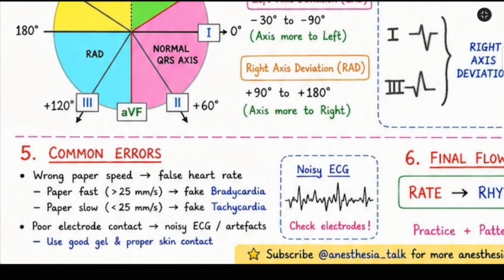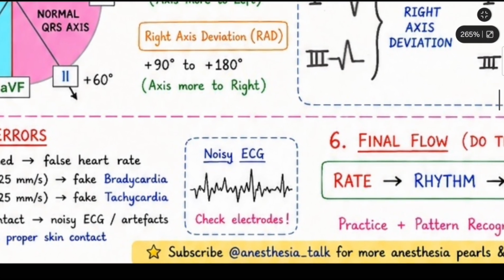The second mistake is poor electrode contact. Loose electrodes produce noisy ECGs and artifacts. Always ensure proper skin preparation, good electrode gel, and firm skin contact before recording the ECG.